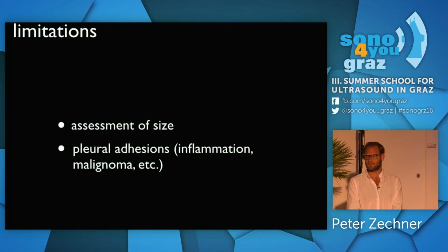So, just for some clinical questions, what do you think is a good way to react if you find a pneumothorax? Should you always do an immediate intervention like chest tube insertion, or when would you do which procedure?